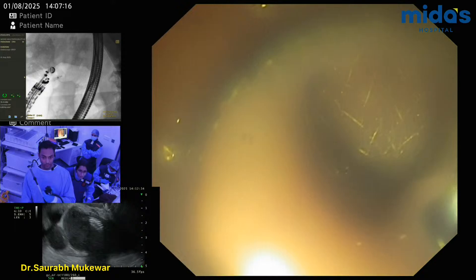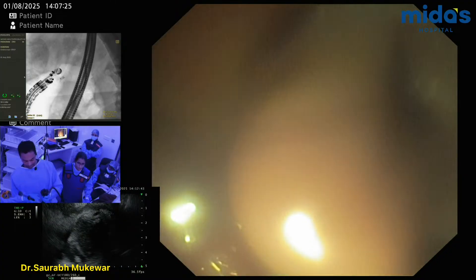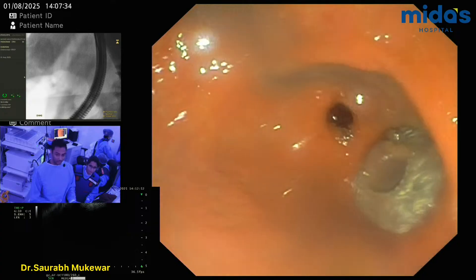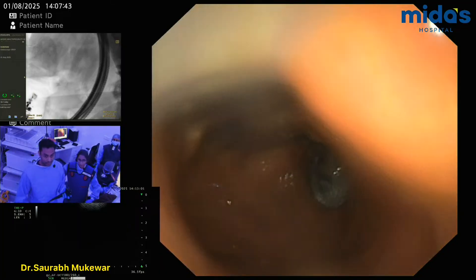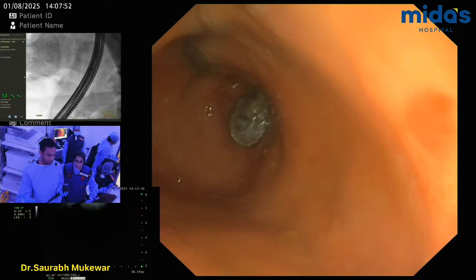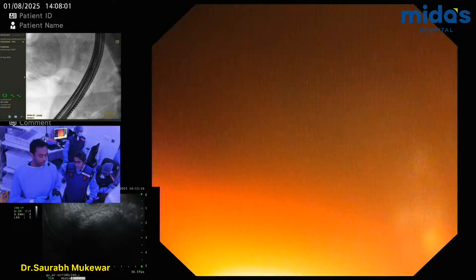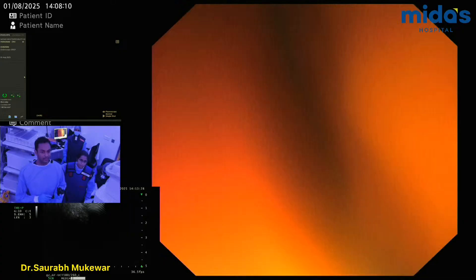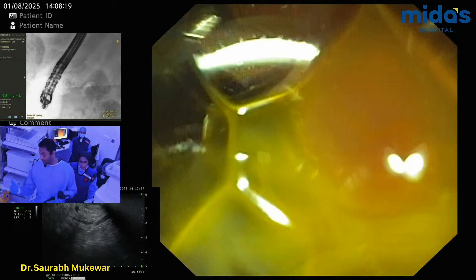Now one thing — you don't want to yank the stent out with the introducer. So will you put a stent through this also? No. Pigtail placement is a plus-minus thing. In this particular case, I'm not doing it. Why would you do it? It's for two reasons. One, to reduce migration. And second reason is to prevent any obstruction from a stone that's inside. Now in this particular case, there is no big stone. And migration — antrum has a higher propensity for migration. But what I'm going to do is call him back in three to four weeks. It doesn't migrate in three to four weeks. So right now I don't feel the strong need to put an additional plastic pigtail through it. But in select cases, I do. Pus — we should culture it.